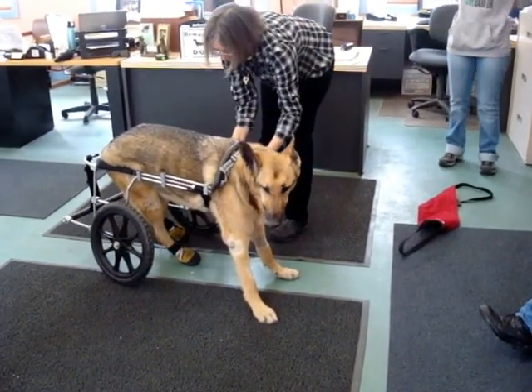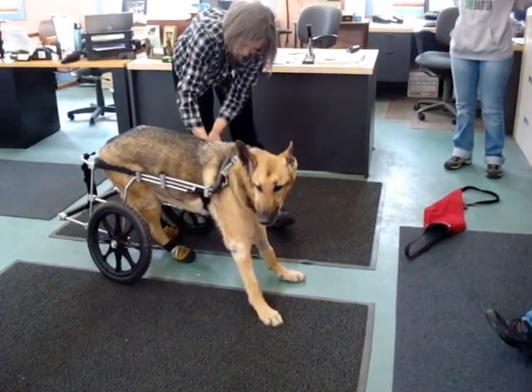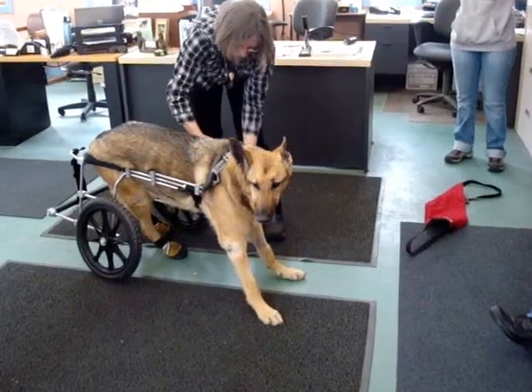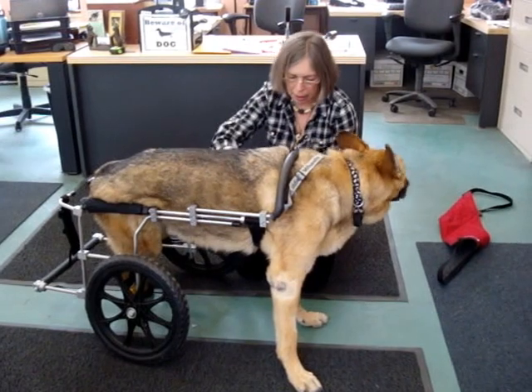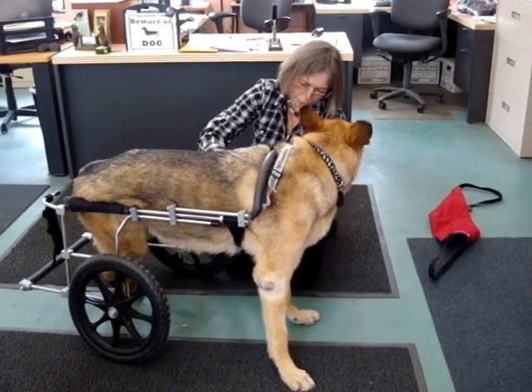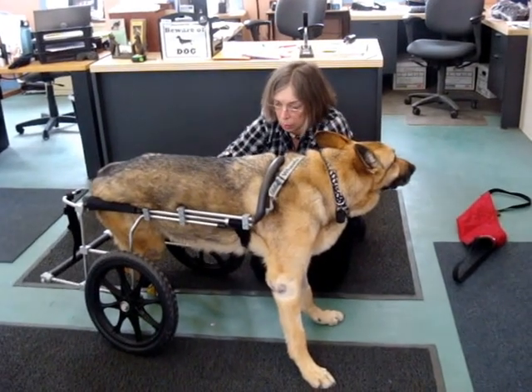Once the dog is in the saddle, it's really easy because the cart is supporting the dog. You're a movie star. Look at the tail. Now, I forgot to take your belly strap cover off, so we have to do that now because I need to adjust your support strap.